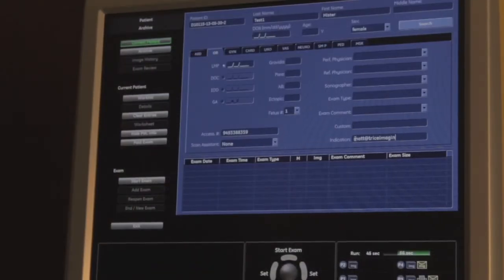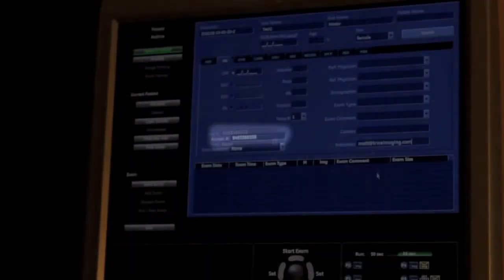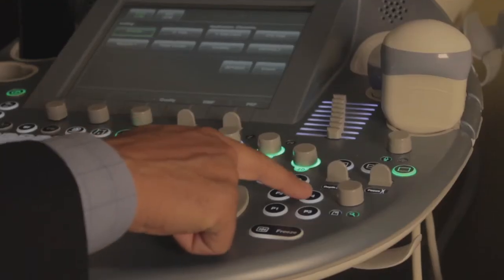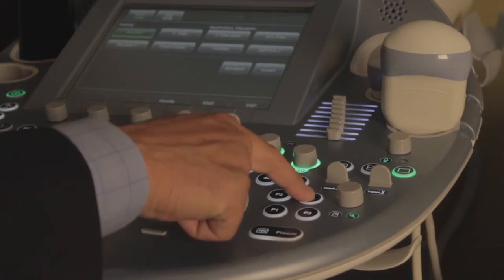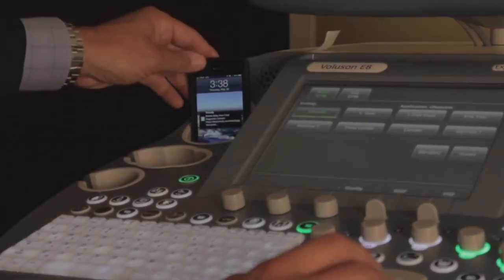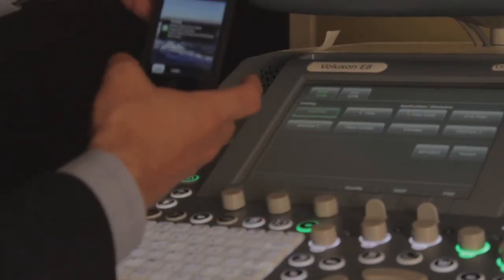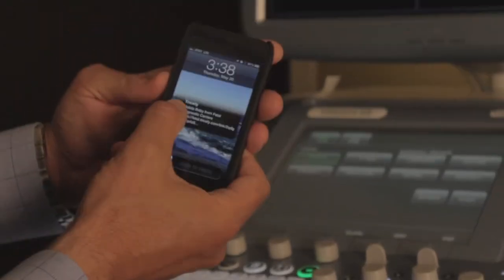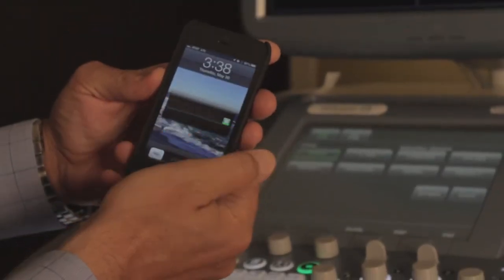Add the patient's mobile number and/or email address in the chosen fields, the most common being patient comments, a session number, and indication fields. When images have been acquired, press the print or store button that has been pre-configured for patient images, and within 30 seconds the patient will receive a secure link to their study on their mobile device.